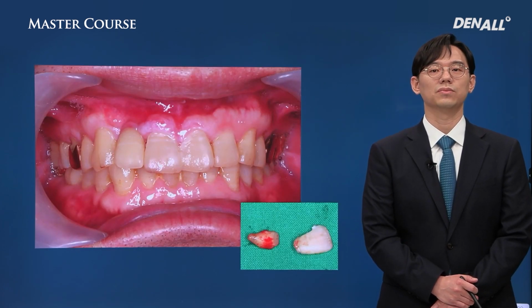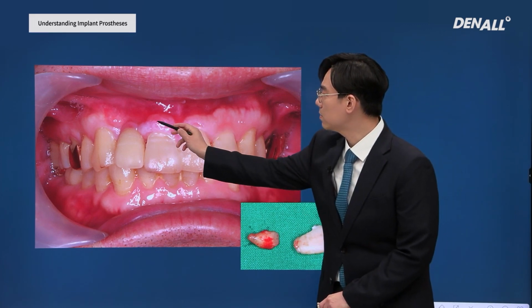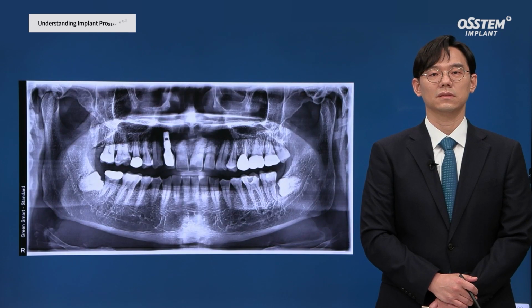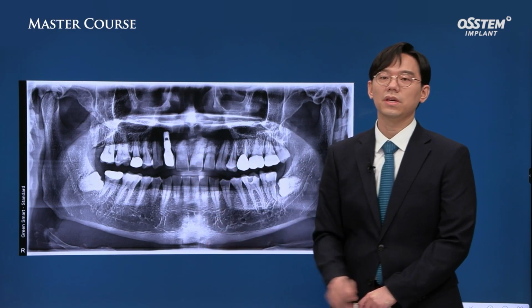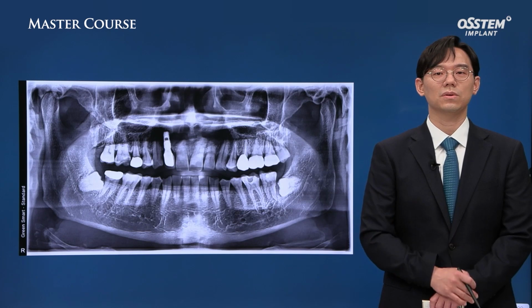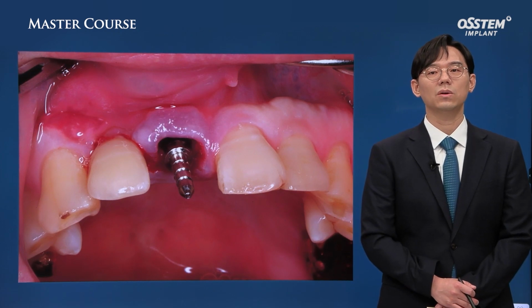The person had a fractured anterior tooth. Number 11 was mobile. Looking at the pattern, I felt a fulcrum over here, and fracture in the middle of the root was confirmed. In number 12, there was already an implant prosthesis, so bridge treatment was not recommended here. In the panoramic image, you could not see a periapical lesion, so immediate implant placement was decided. Atraumatic extraction was performed.